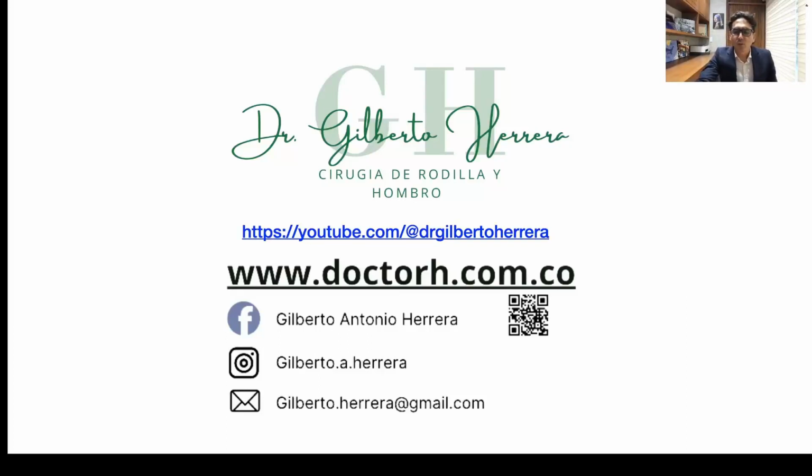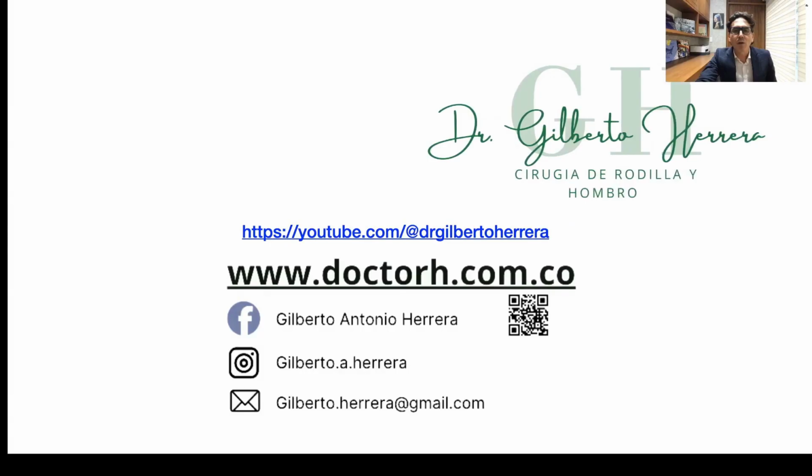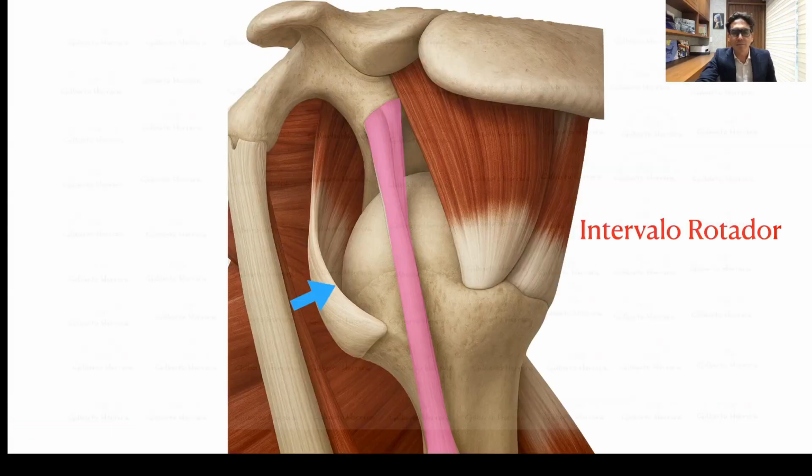We continue now with our Musculoskeletal Ultrasound course, focusing on the shoulder anatomy segment. Now we're going to talk about the rotator interval.